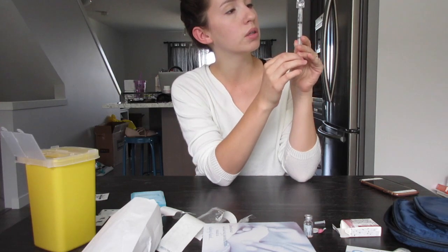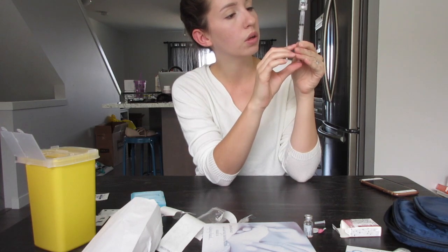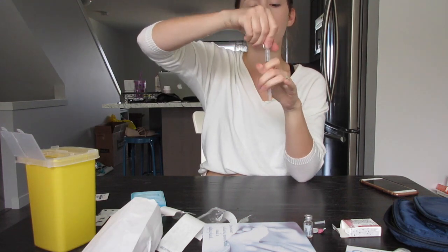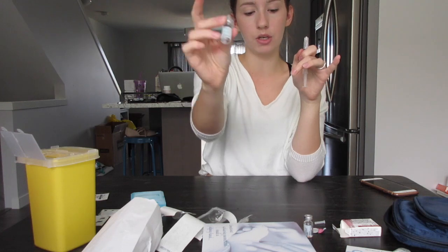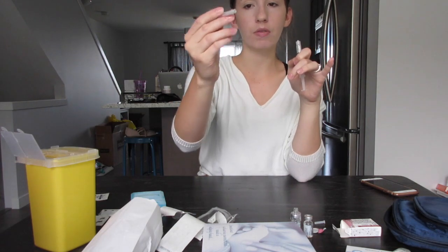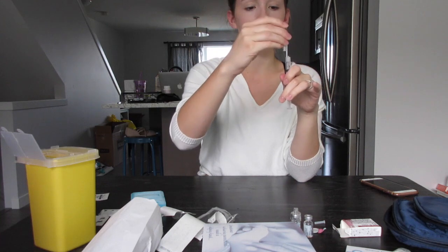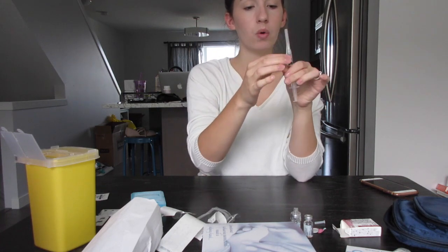All right, so you'll take it in like so, back to one, and now you can unscrew the cap. All right, so now you are actually finished with this vial and Q-cap. What you have next is your needle. So it comes with a protective cover, but only one cover, unlike the Puregon pen. So you're just going to screw it on until it doesn't go anymore.